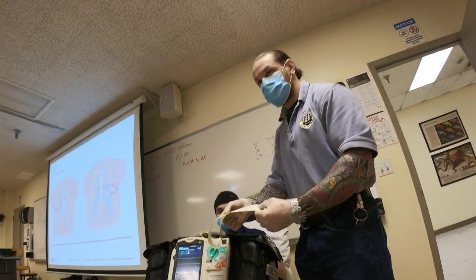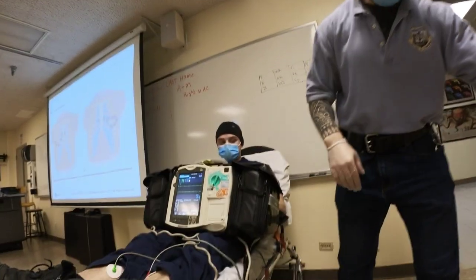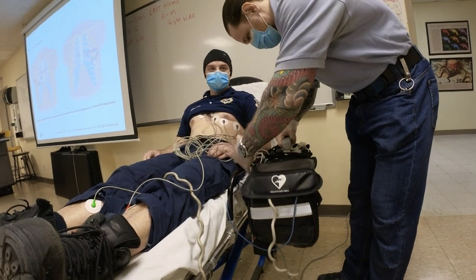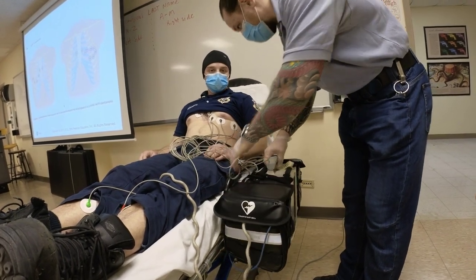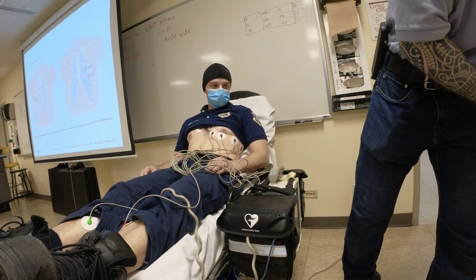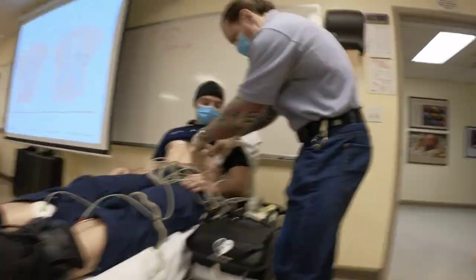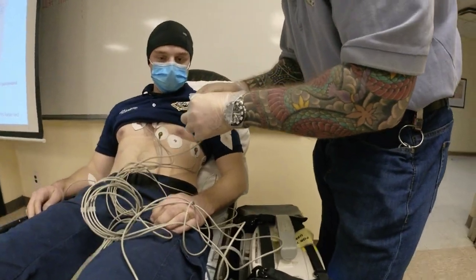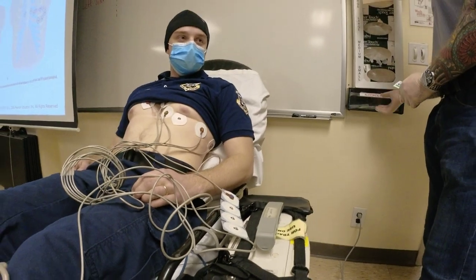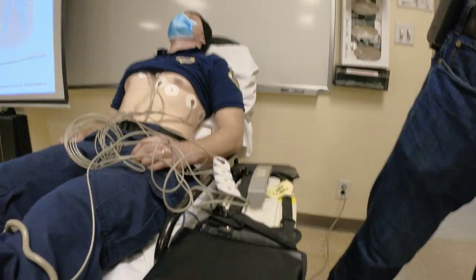So this is a standard 12 lead. I don't have to relabel this one. Now let's do the 15 lead. For the 15 lead, you're going to have to relabel. So what I'm going to do is take my leads. The first thing I've got to do is take V4. Where am I placing it? Right side. Good. Same thing with the skin prep, right?